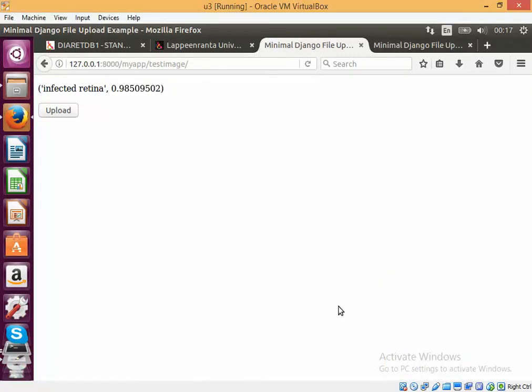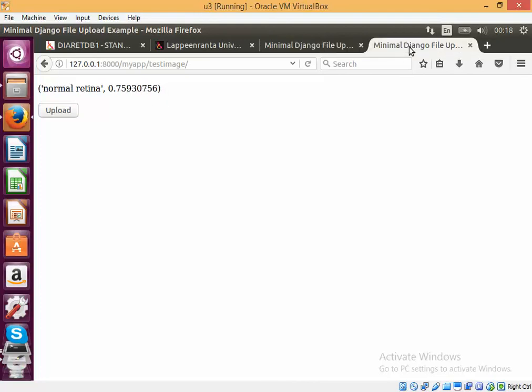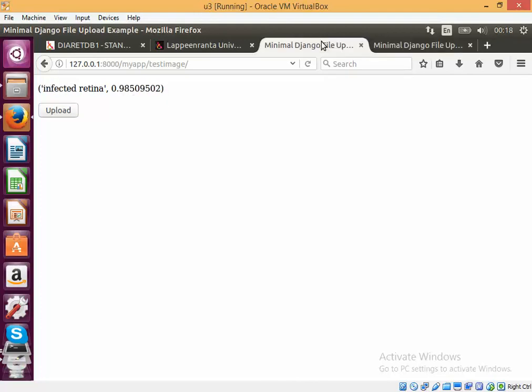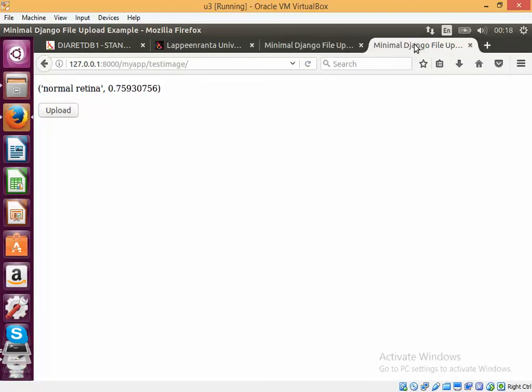Okay, so we can see that the response has come back. And we can see that both of these images have been classified correctly. So it shows that it can handle multiple requests and it can serve many users at the same time.